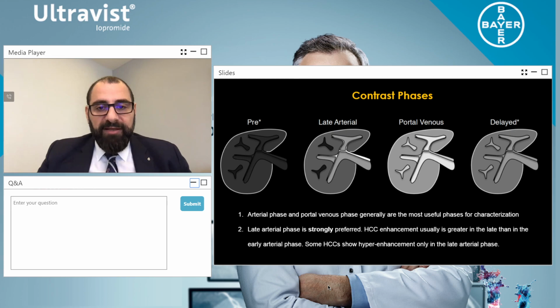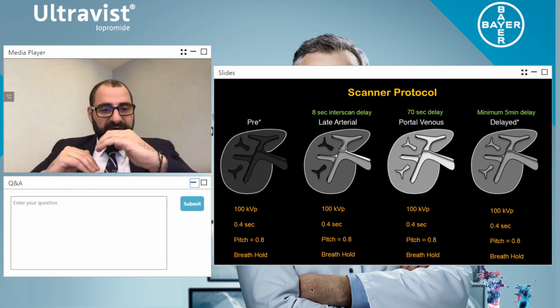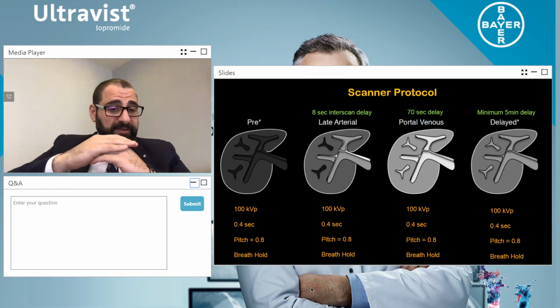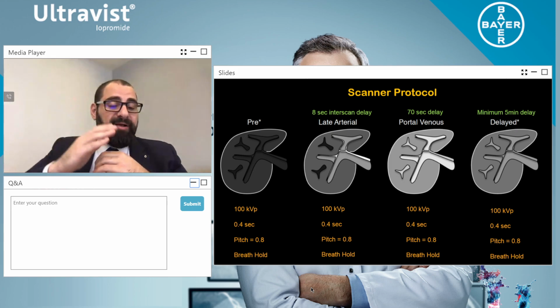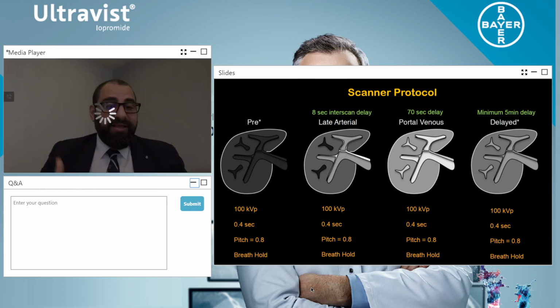So if we keep going, let's look at the protocol. I always structure my protocol to be exactly the same for all my phases. So if we look at the first line below the images, I always have a 100 kVp protocol for every single sequence. Second, I always use a fast rotation time. Because what happens is if I have the liver here and I have my lung there on top, it starts to flutter and you have differential movement. And this is because of breathing and the ability of the liver to actually want to push back up so we can push air back out. So it doesn't think you're underwater and you're suffocating.